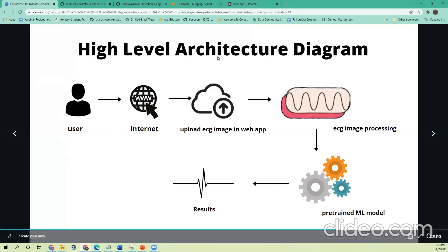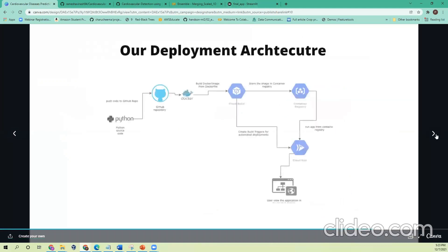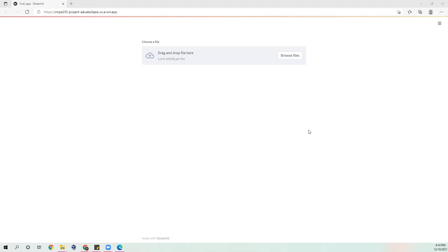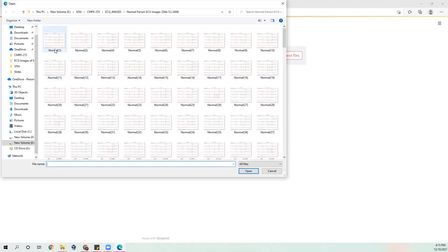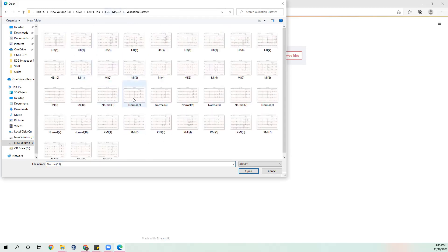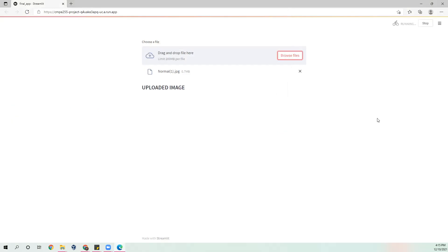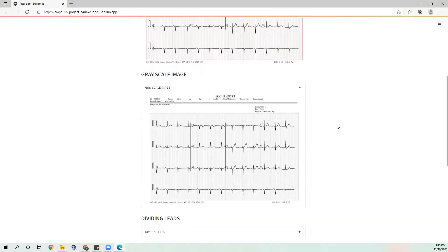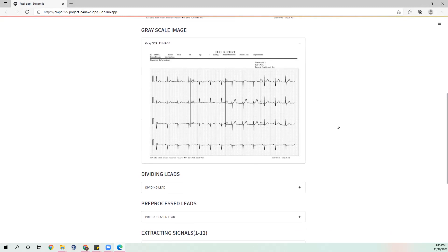Now let's see the same in a demo. Here is the demo of the project. I'll start by picking files of different types of abnormalities and go through how the prediction works. To start with, I'll be taking a normal image from the validation set. This is the image that has been uploaded, and we can also see the other pre-processing steps — this is the grayscale conversion.